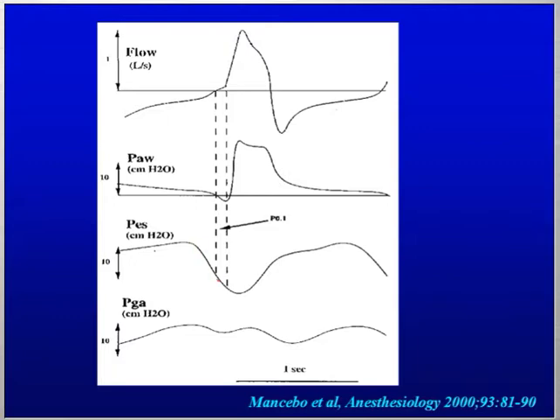But you see that in terms of esophageal pressure swings, this is coming very late compared to the beginning of the effort, which started here for the patient. So all this phase is before any possible detection of the ventilator based on signal at the airway. So this is the intrinsic PEEP, which necessitates for the patients to make an effort to counterbalance this positive pressure before any detection can occur on the ventilator.